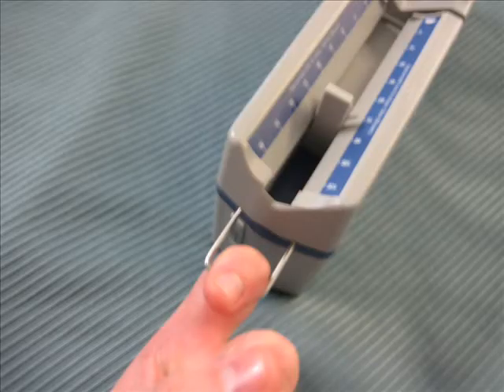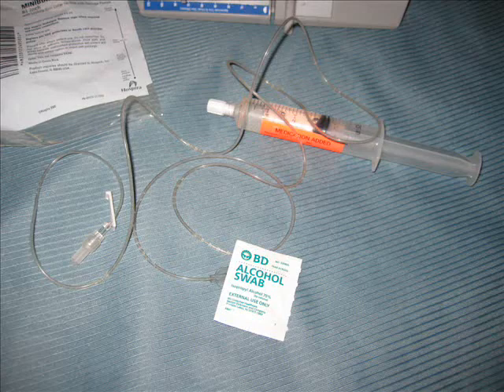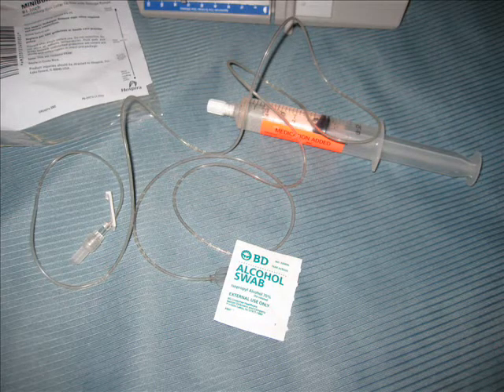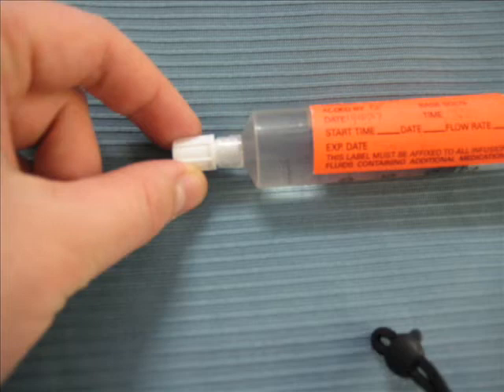This hook allows you to hang the syringe pump on a pole, but you do not have to use it. Here is the line outside of the wrapper. You will need an alcohol swab and your medication to prepare everything before you go into the patient's room.